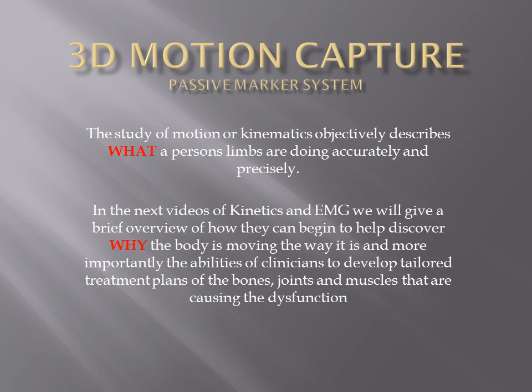In the next 2 videos, we will show you how kinetics, or the study of forces, and EMG, the study of the electrical activity of muscles, will help show why a body is moving the way it is, and more importantly, how clinicians can use this information to develop tailored treatment plans for the bones, joints, and muscles that are causing that dysfunction. Thank you.